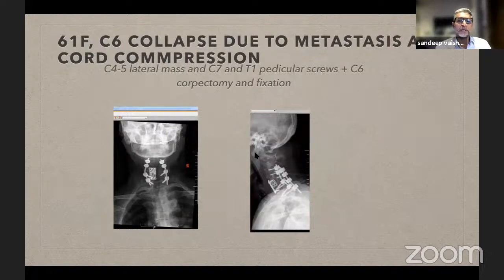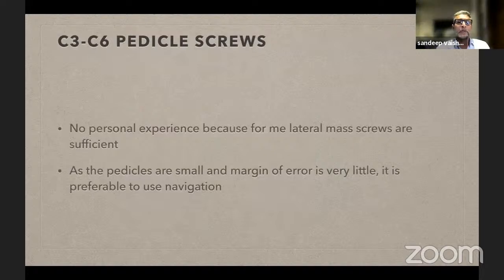Again, this was a patient with 2-level metastasis. So I did an anterior corpectomy and fixation and then cervicodorsal fixation. Now, a couple of slides on C3 to C6 pedicle screws. I have no personal experience because for me, lateral mass screws are sufficient. I never needed to revise them.